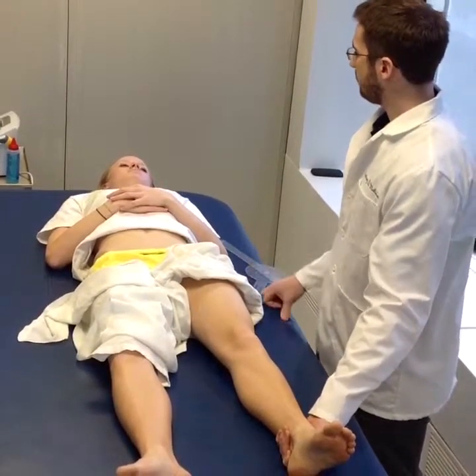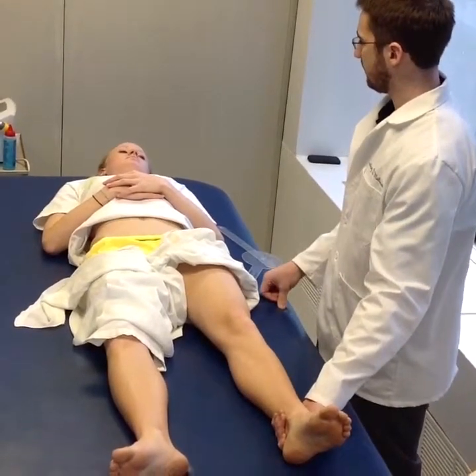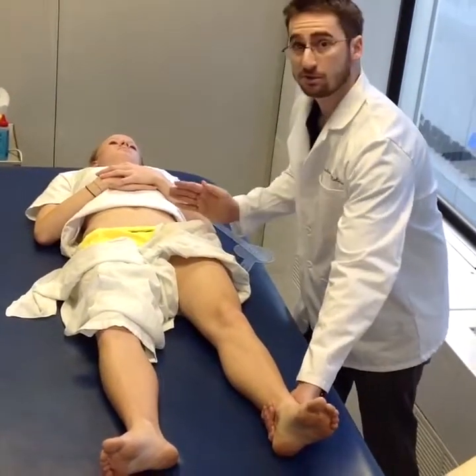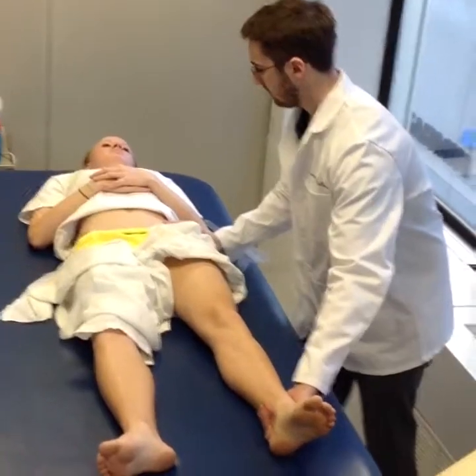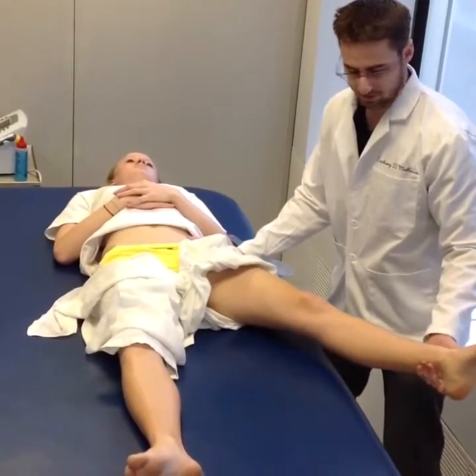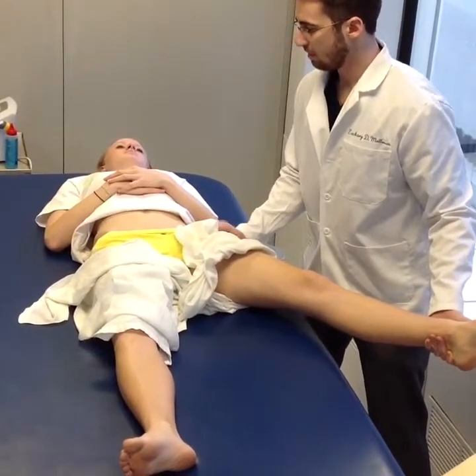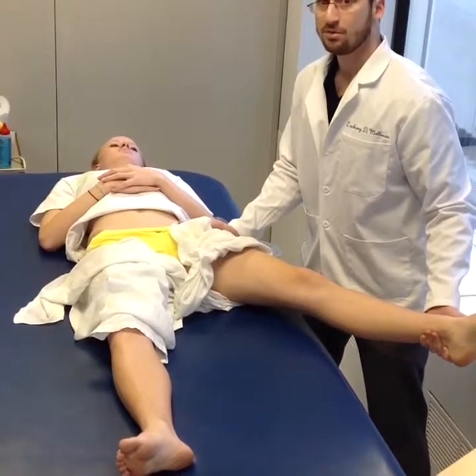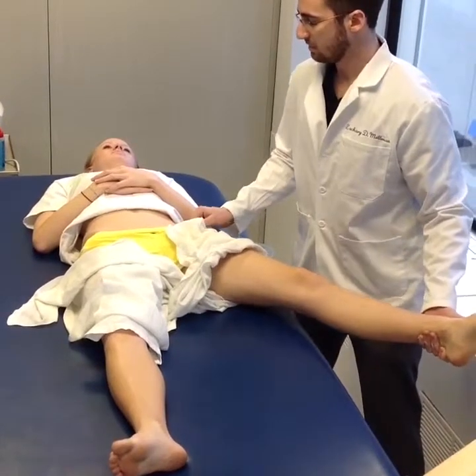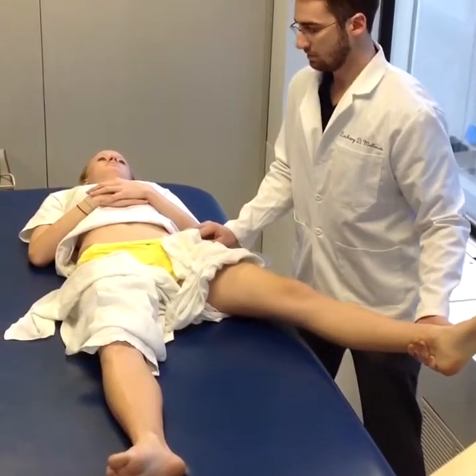Alyssa, I want you to stay completely relaxed as I move your leg to the side. I'm going to palpate her ASIS, and I'm going to do this first without the goniometer. Making sure I keep her ankle in neutral and feeling her end range. You can see if I pull hard — and you probably don't want to pull as hard as you can with an actual patient — she starts to compensate. That's the beginning of end range, right about there.